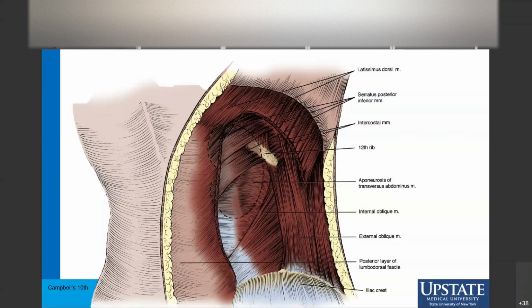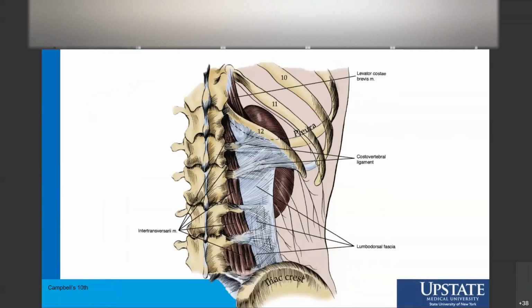There's fascial layers that we have to think about, especially the lumbodorsal fascia. And really, the paraspinous muscles are going to prevent any access too close to the spine. So here we can sort of see a stripped down version of this with a lumbodorsal fascia that we have to dilate through during our access. This fascial layer can prove problematic, especially in people who have had repeated procedures, multiple PCNLs. This will be very thick. You'll need a balloon that can accommodate a very thick fascia to dilate that.